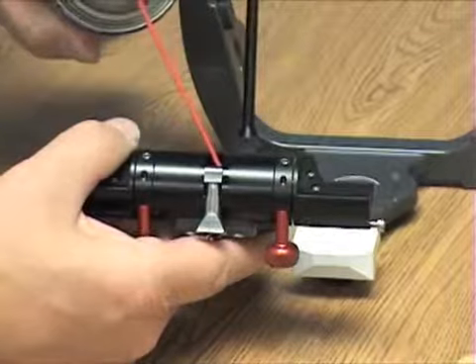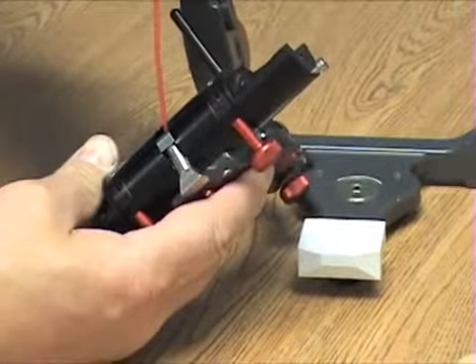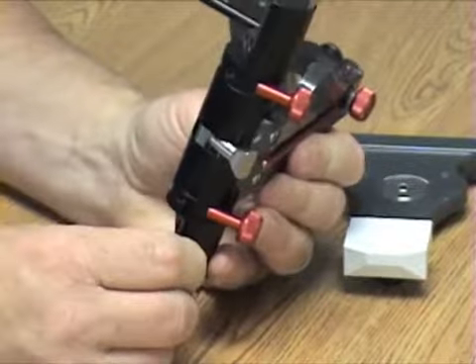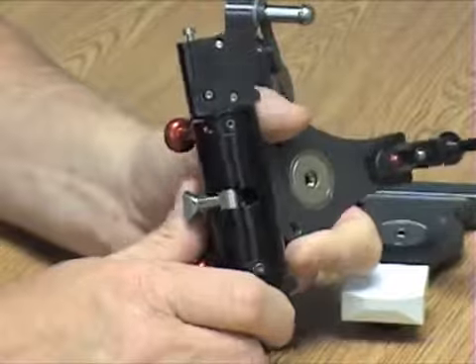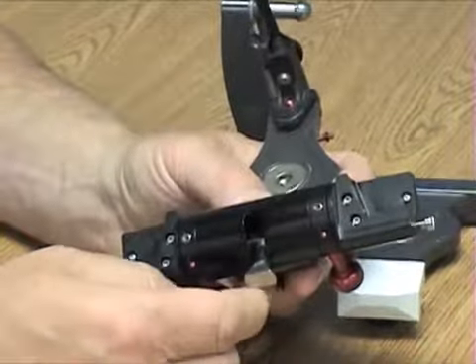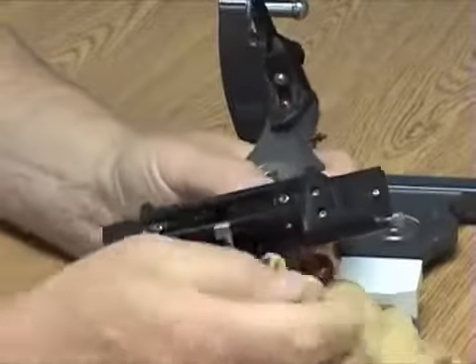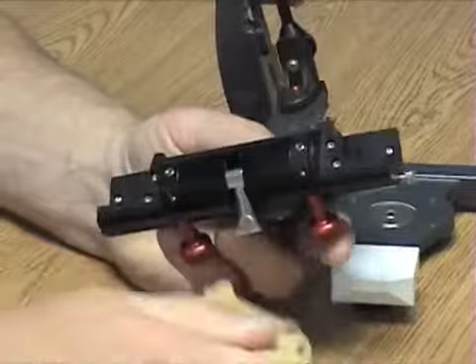We're going to come in at an angle and give her a shot, and then go to the other angle and give her another shot. That allows the oil to run down through the metal on metal, as I was speaking before. We'll flip it over and do the same on the other side, and then go through the latch and unlatch position. On a 310, this is all you're going to be able to do to lubricate your articulator, since it has a fixed fossa at 25 degrees, so they're not removable.